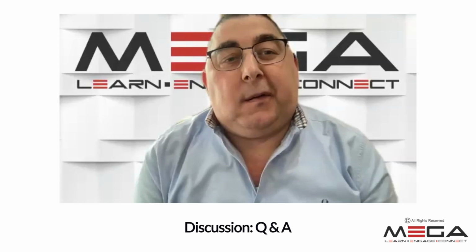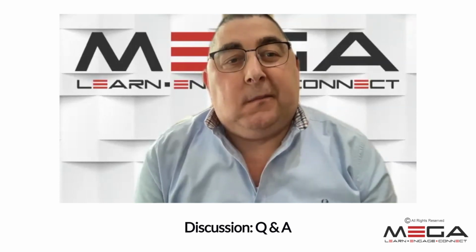You may just close, Dr. Anchitya. Yes, it was a nice and wonderful session. Thank you, Dr. Saad. Thank you, Dr. Esam Manna, for asking those beautiful questions. Actually, it is very important to differentiate between CPAP, BiPAP, and PEEP, especially for the residents. And I just want to add one point to this. When giving any non-invasive ventilation through a ventilator, remember that when you're considering PEEP and the pressure support mode, the IPAP is basically pressure support plus PEEP. Many times we forget that, and we calculate the pressure support as the IPAP. And obviously, everything has been explained very well by Vikram.